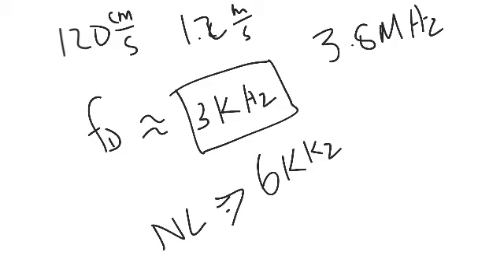And so how do we do that? Well, let's go back to our drawing, this image. Again, if we're 20 centimeters deep here, to get a 6 kilohertz PRF, it's only going to allow us to image at about 12 centimeters.